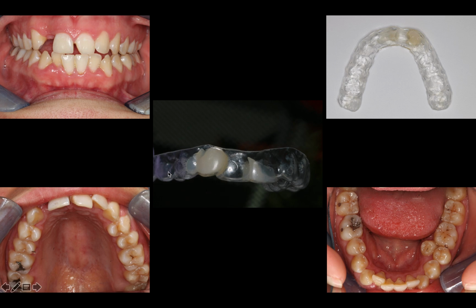And here, this is a picture at our third visit. She's had this Essex retainer for about 2.5 months at this point. Remember, this is a patient who was not regularly brushing or flossing, and I just put this picture up to show how clean she actually kept her Essex retainer, which really showed that she was paying attention to what we were talking about with oral hygiene and just improving her home regimen.